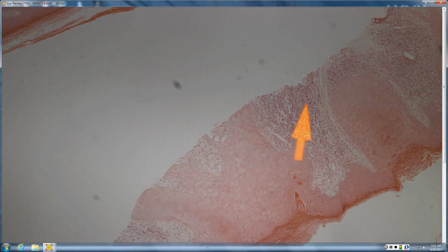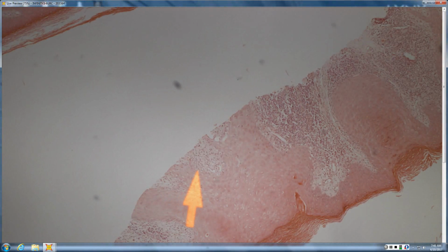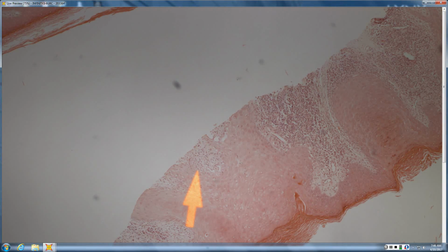When you have a band-like infiltrate and loss of your basal layer with squamatization, what kind of tissue reaction are you looking at? Yeah, interface. And more vacuolar or more lichenoid? More lichenoid. So what kind of things can give you lichenoid dermatitis? Pityriasis lichenoides is usually more vacuolar, interface, lymph in every hole. So the lichenoid things often start with lichen, like lichen planus.